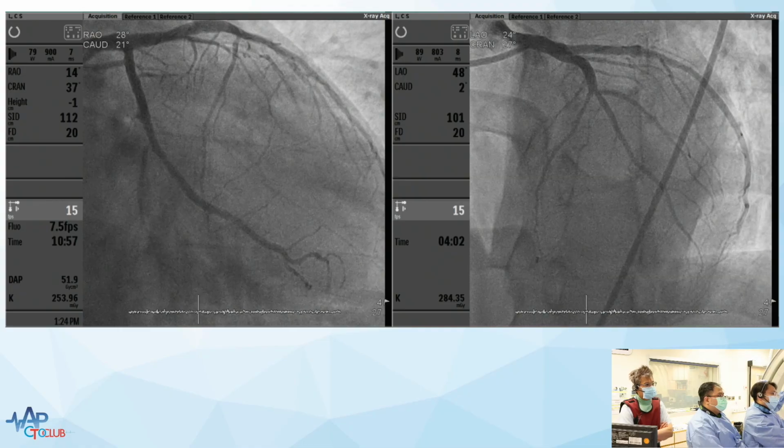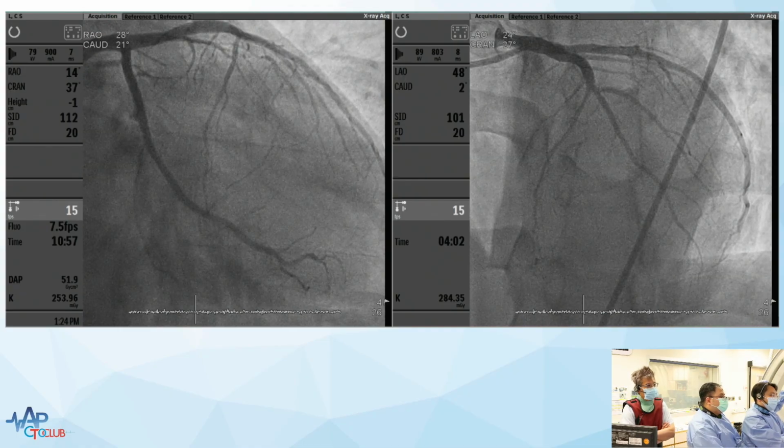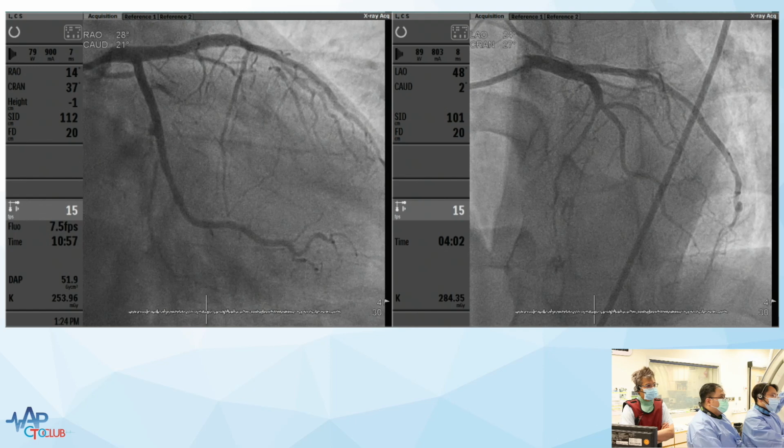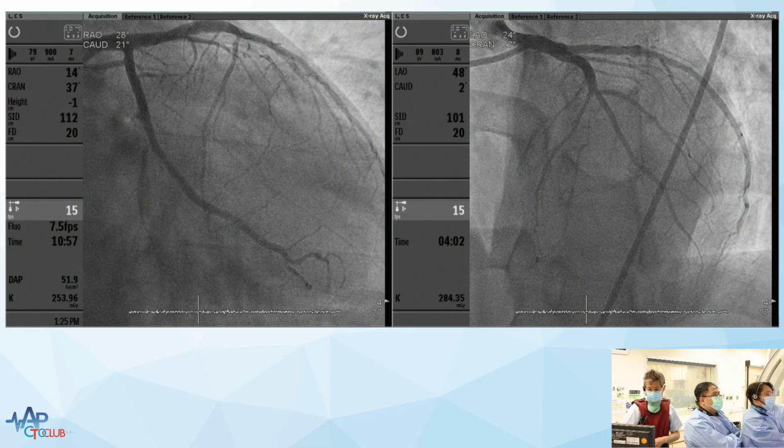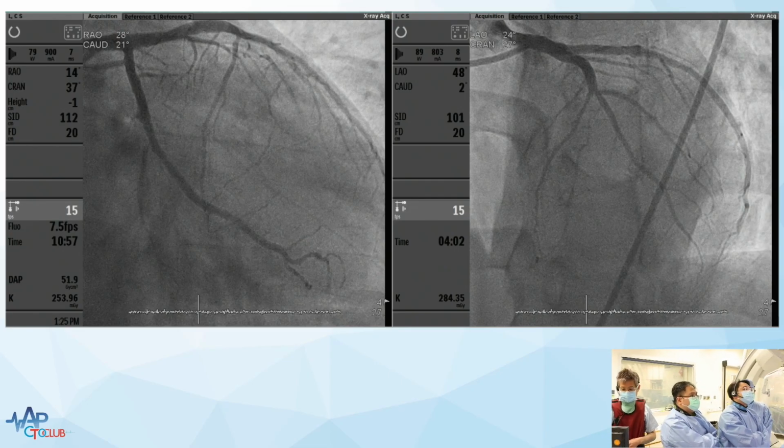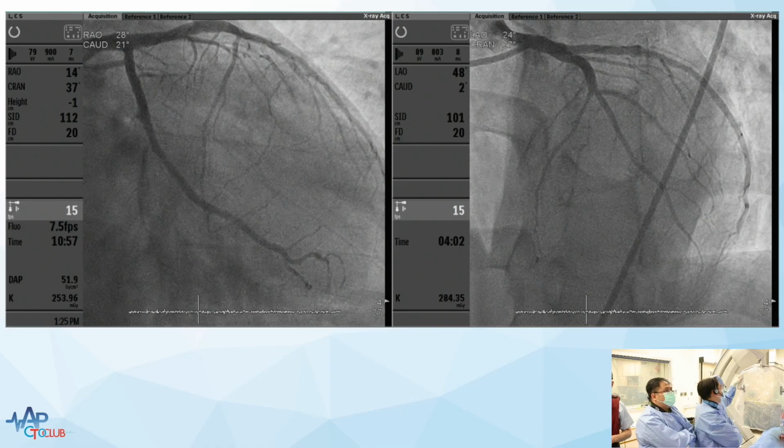Can you see the angio, Scott? Yeah, we can see the angio. So now they're on the stop motion here. Okay. Now we can see that this route is a bridge or microchannel. We don't know. Yeah, but do you see what we're looking at? Yep. Yeah. So IVUS will tell us. Okay. Yeah. So I'll show you the IVUS.